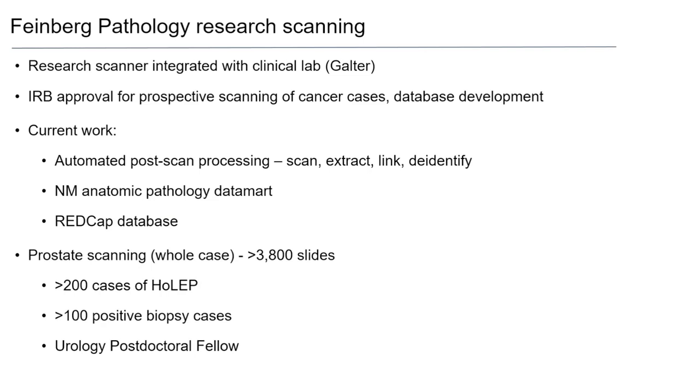For the research, we also have a slide scanner. It's integrated with the clinical lab, which has a lot of advantages that allows us to intercept slides and do prospective studies. It's really the way that we wanted to set this up so that it's right there with the histology and with the other slide scanning that's going on. So we have one of these high throughput scanners that's dedicated for research.